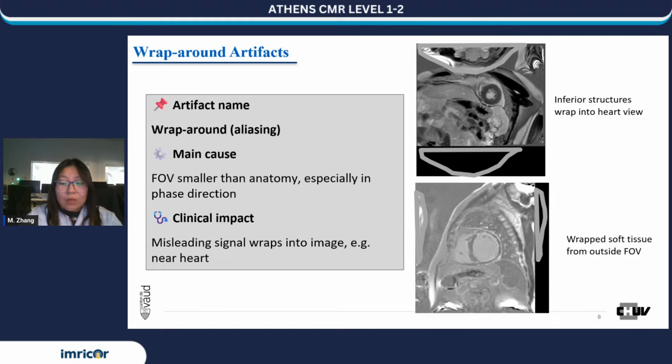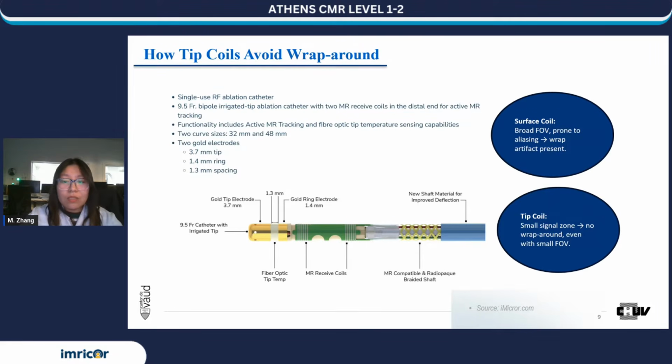Now let's consider a question. Can catheter tip imaging also suffer from wraparound artifact? To answer this question, let's take a closer look at the structure of the catheter. This catheter closely resembles the one currently used in our experiment, an ablation catheter manufactured by Imricor.